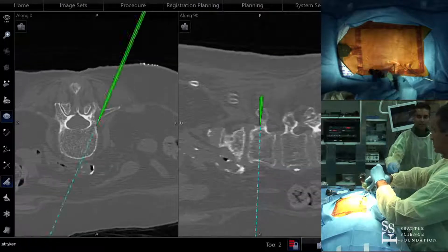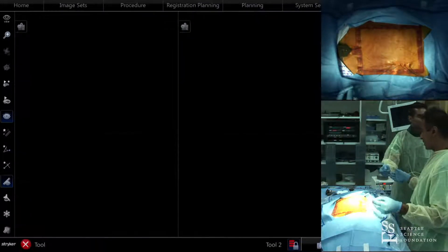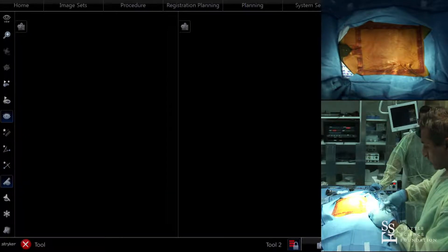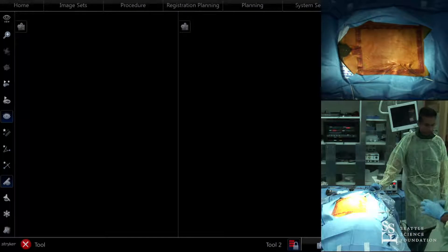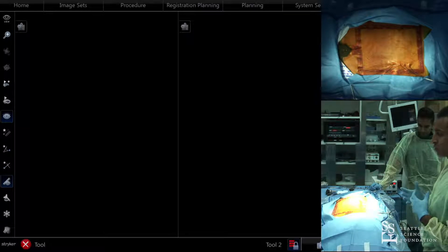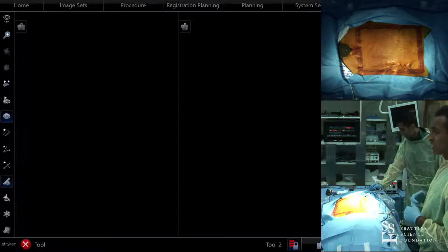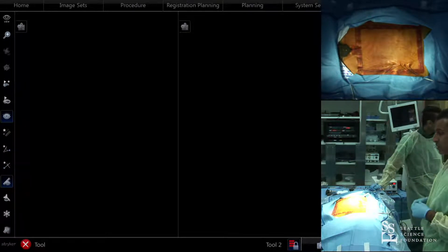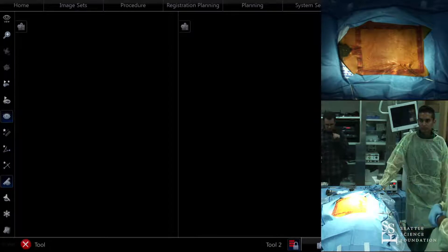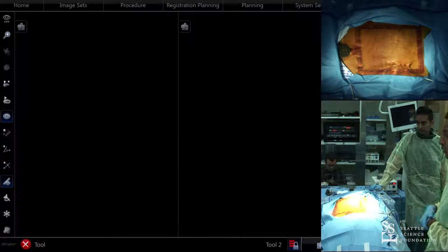Regarding radiation: the patient does get a little more with navigation, but with the Ziem the amount is fairly low — not as much as a true CT scan, though it's something to be cognizant of. Overall, it's really the surgeon at risk because we're doing three or four surgeries a day. The amount of radiation we're getting two or three times a week is much more significant. We've talked about randomizing and studying the differences in radiation exposure in fluoro-based versus navigated cases for everyone in the OR.